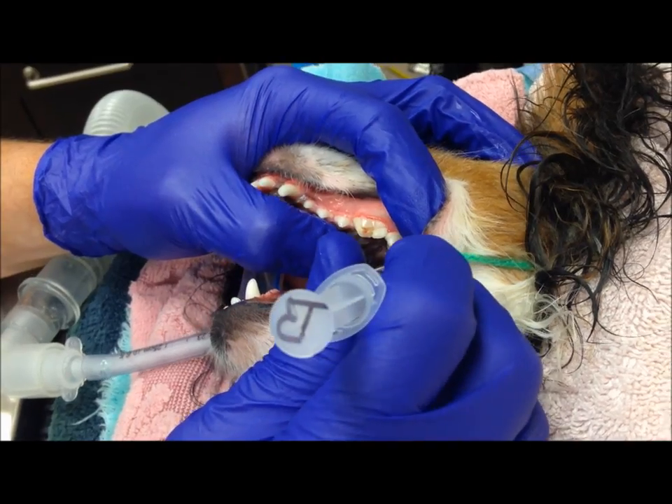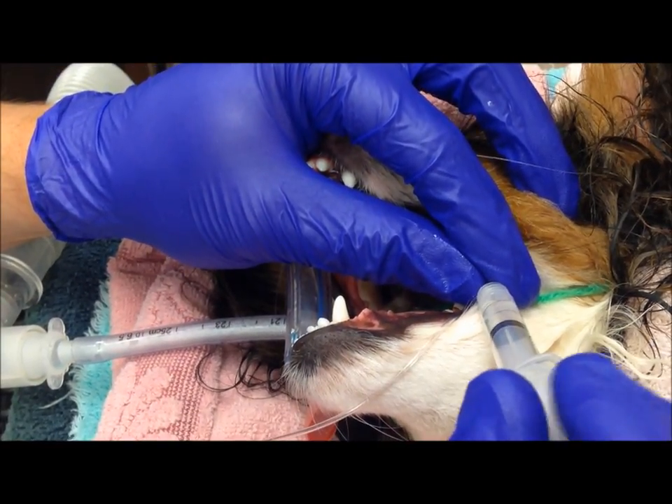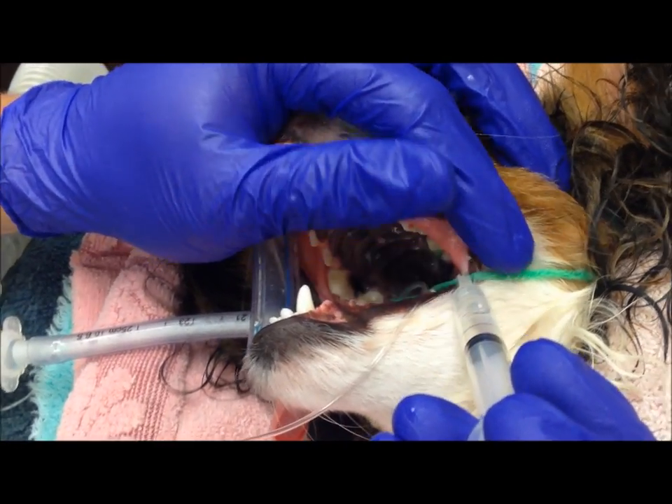I'm going to be doing a local nerve block right back here. I'll insert that needle, pull back slightly to make sure I'm not in a blood vessel, and inject a small amount of a local anesthetic called bupivacaine.